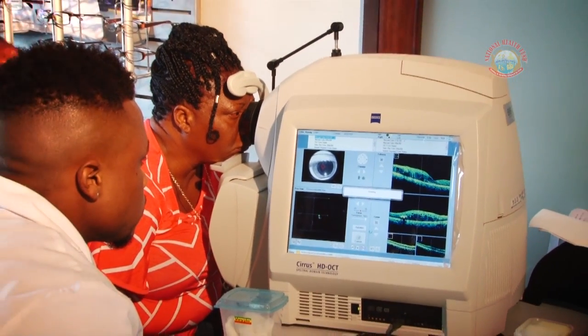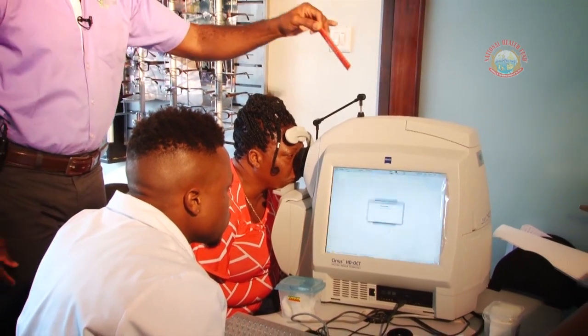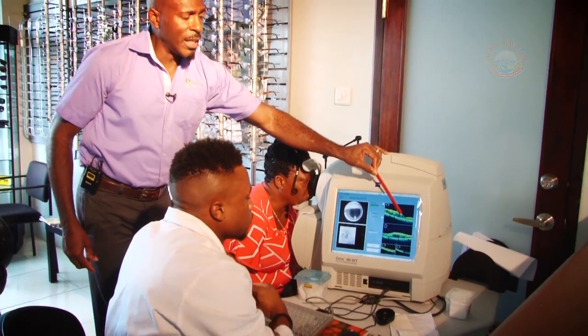What we do here is provide the patients with other tools that will assist us in planning for the patient's further care. And those tools include the OCT, optical coherence tomography, which shows you deeper structures, cross sections of the retina, and even deeper than that, structures that I cannot see with any of the instruments in here. I also do photography because that helps to keep track of the patient's progress.